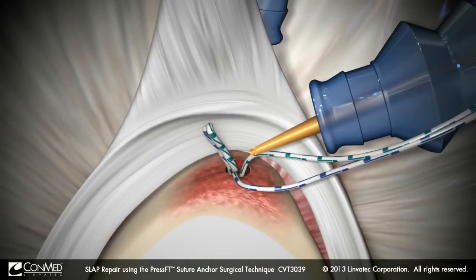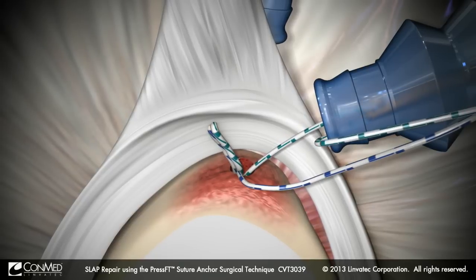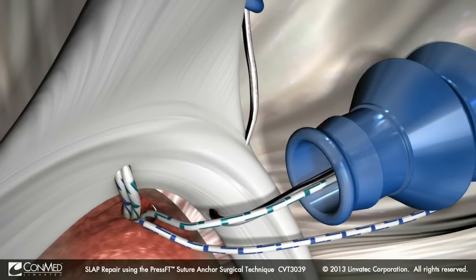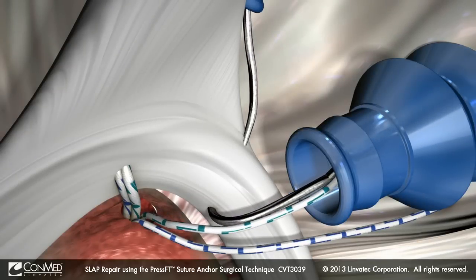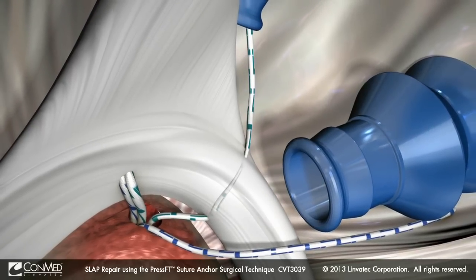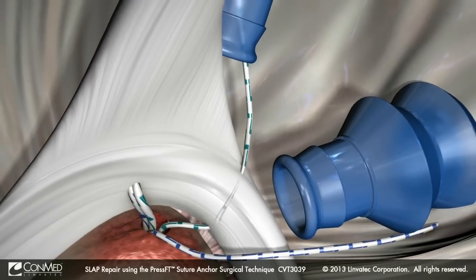Using a crochet hook, retrieve one of the limbs of suture from outside the anterior mid-glenoid portal. Using the spectrum crescent hook, shuttle this second limb of suture back through the labrum just adjacent to the anterior attachment of the biceps and closer to the glenoid, resulting in an anterior mattress stitch.